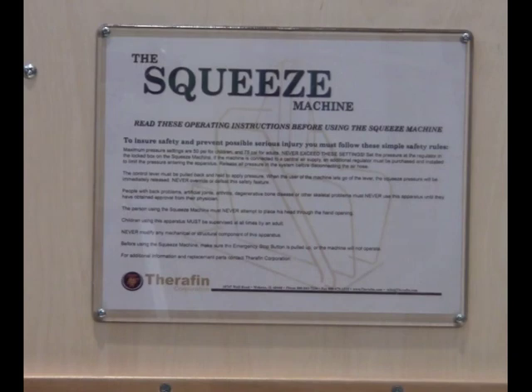One of the first things we want to do when we get ready to use the machine is obviously read the operating instructions. On the front of the machine here we have some basic rules that we need to go by. One is on the maximum pressure that the machine can be used at. There are safety valves built into the machine itself and to the air compressor that restrict it from going too far. But basically what we want to do is set the maximum pressure anywhere between 50 pounds per square inch, or PSI, for a child, and up to 75 pounds for an adult. We never want to exceed these settings, so it's important that we set the pressure prior to using the machine.